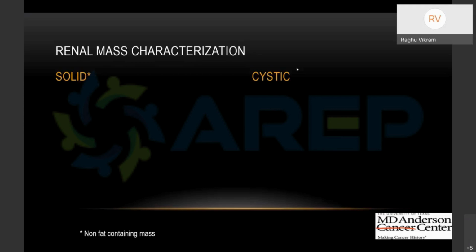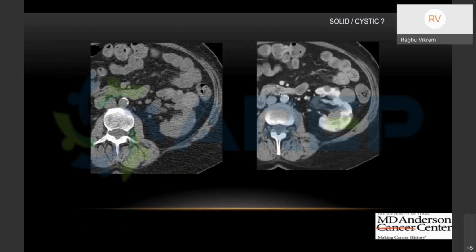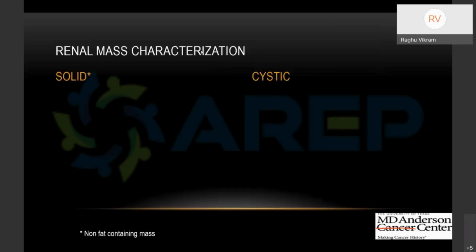And we won't talk much about cystic renal masses because that is Bosniak criteria, and we have a different kind of schema of classifications and everything. So we won't talk about cystic renal masses. We'll talk mainly about solid renal masses. So having said that, the first question you have, once you have renal masses, the question that you need to answer, is it solid or is it cystic, right?